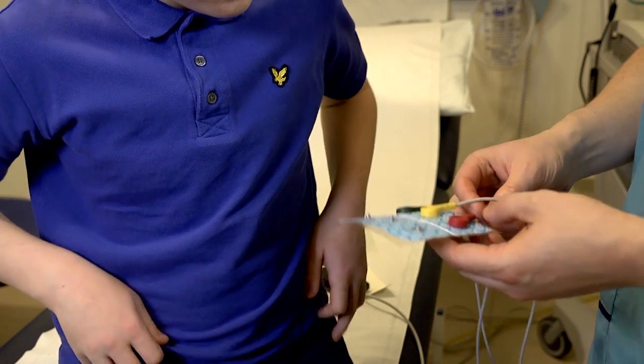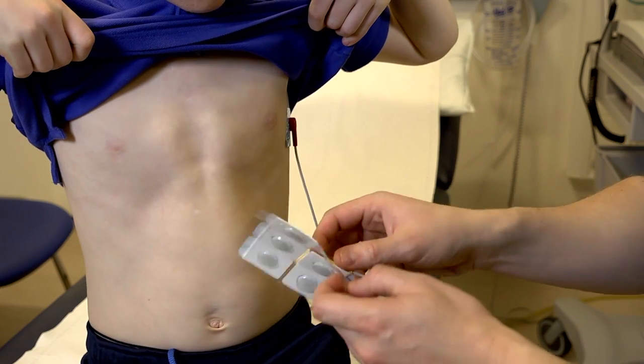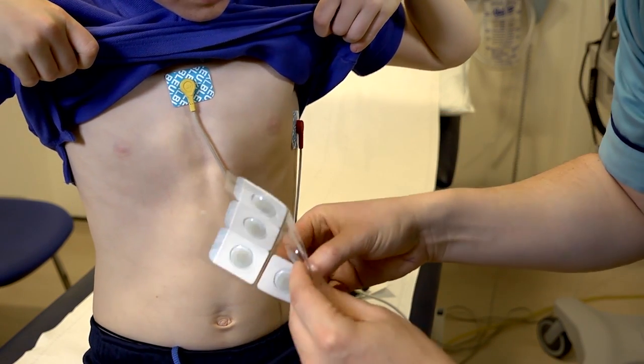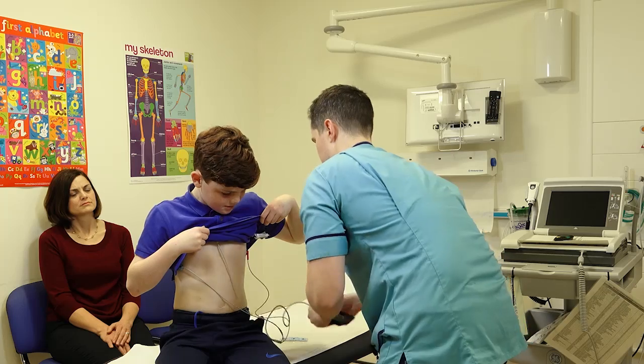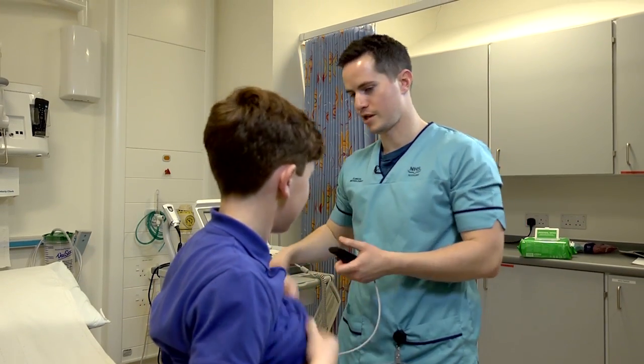If you don't mind lifting your shirt up for me. How does that feel? Feel okay? Yeah. Okay, you can put your shirt down now.